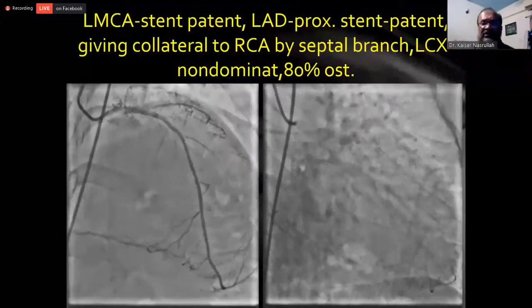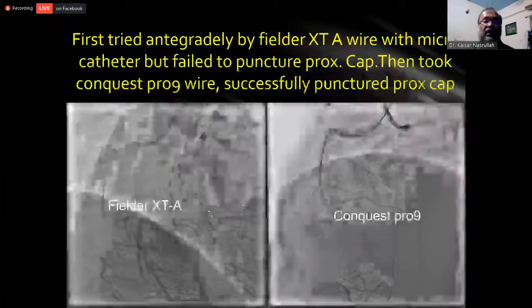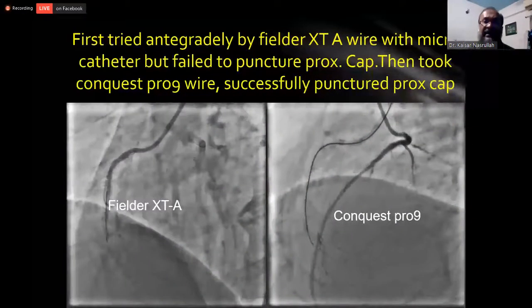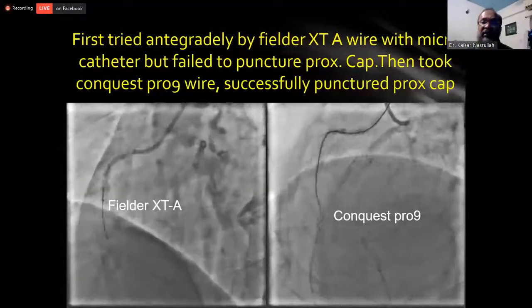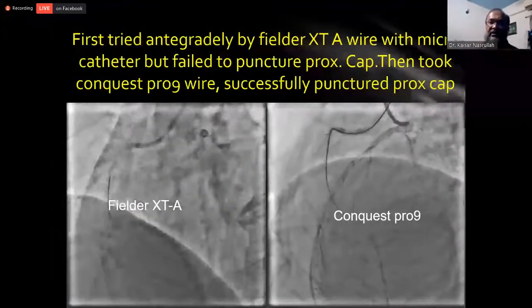So, summary: this is an RCA CTO, proximal stump blunt with a side branch, no calcification, bending less than 45 degrees, CTO length is 20 millimeter, and there was a previous attempt. So the J-CTO score was 3. First I tried antegrade again with a Fielder XTA wire with a microcatheter, but failed to puncture.